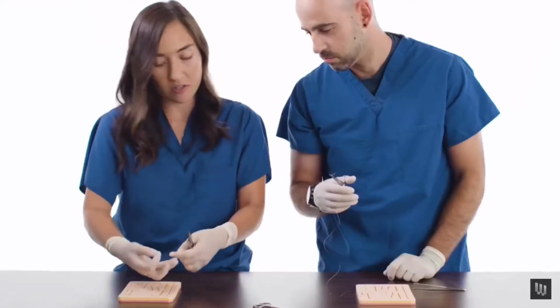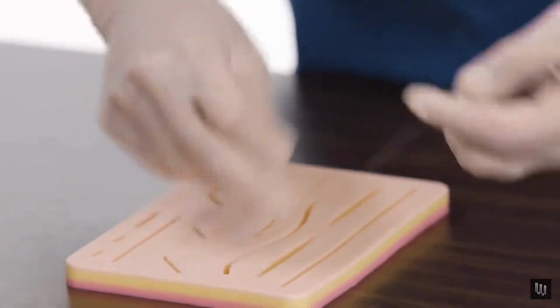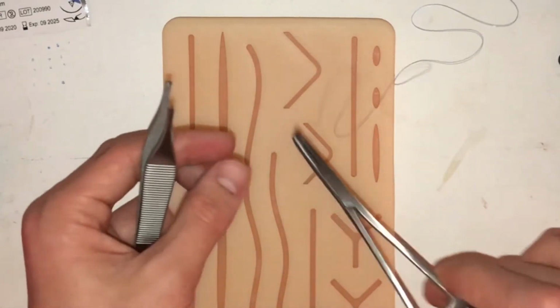Oh, okay. And I'm just gonna do a couple of one-handed ties. Usually 3 or 4 for this. I'm alternating. And then when you get to the end, I'll show you what to do. So here's where we're going to be working from.